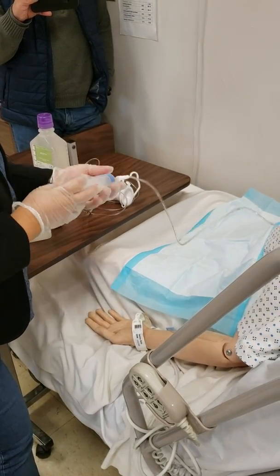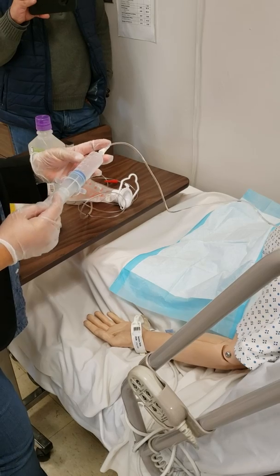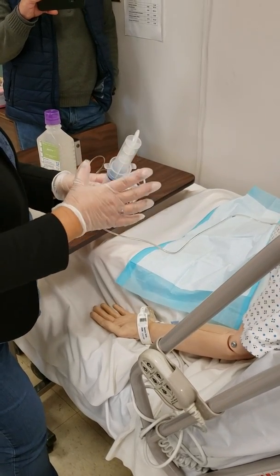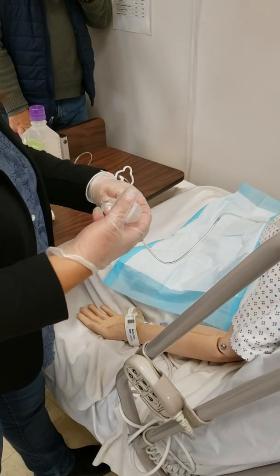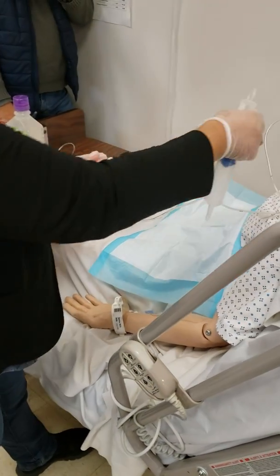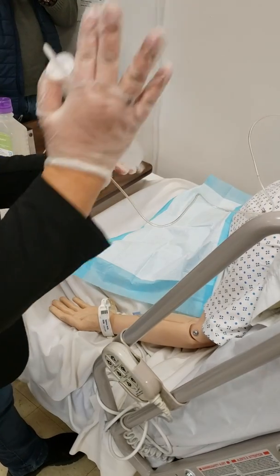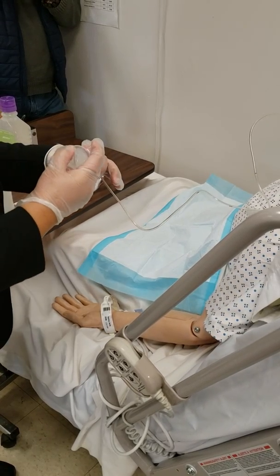The other one is you aspirated, and even a little bit, nothing came out. Even a little greenish juice, gastric acid, there's nothing. It could be in the lung. So you will tell the teacher I could reposition the patient, put him on the other side because the end of the tube could be sticking on the lining of the stomach. So you can reposition the patient and do it again.